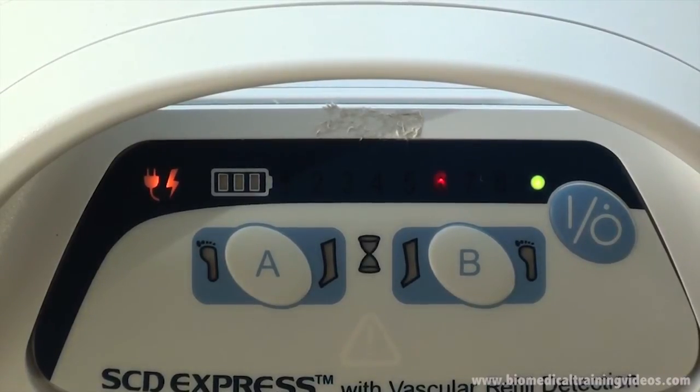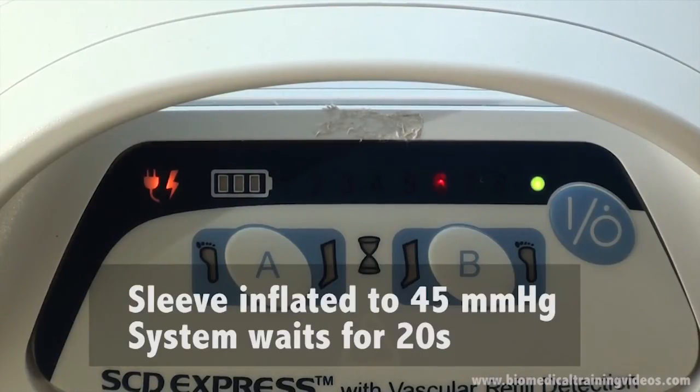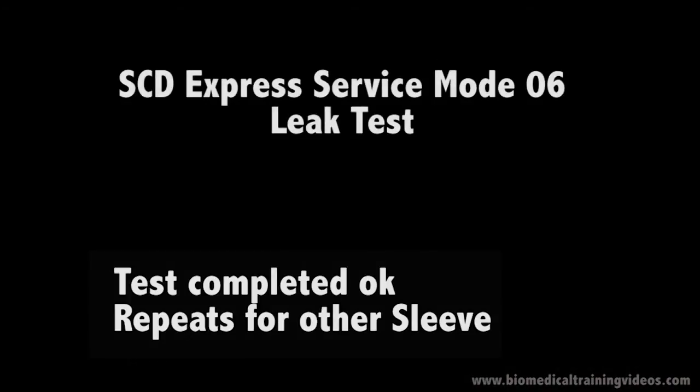The first part of the leak test has the machine pressurise the sleeve to 45mmHg. You then get a single beep to indicate we have started, and it sits and waits for 20 seconds. Another beep indicates it is holding for a further 20 seconds to check for a leak. A final beep indicates a pass, and then it would repeat for the other sleeve if you had one connected.